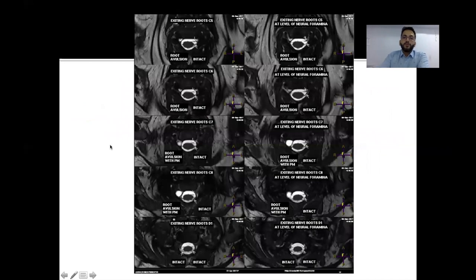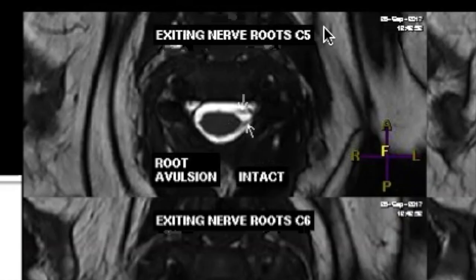So this is a patient who has got nerve root avulsions involving right-sided C5 to C8 nerves. So we have taken axial 3D SPACE or a FIESTA sequence here. So this is at the level of C5 nerve root. We can see that the ventral and dorsal rootlets are seen on the left side but they are not seen on the right side.